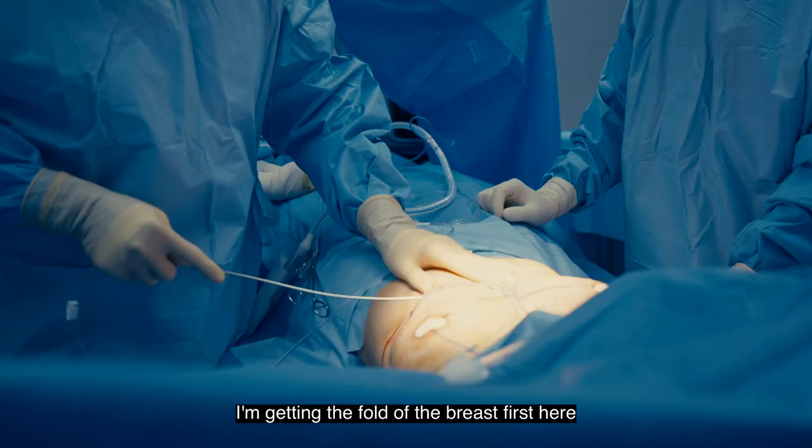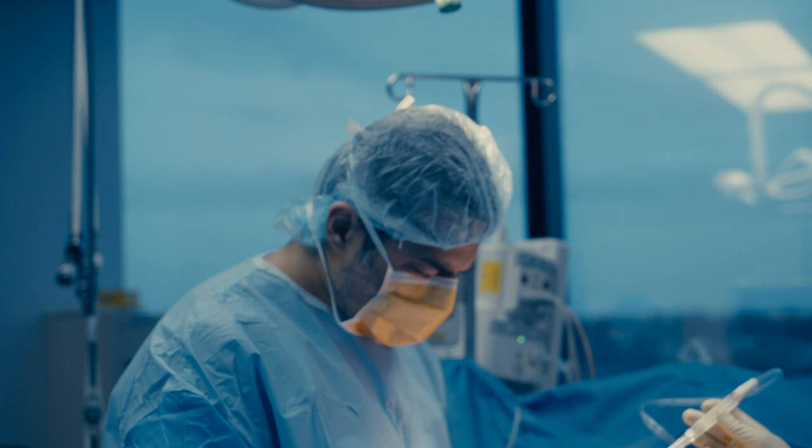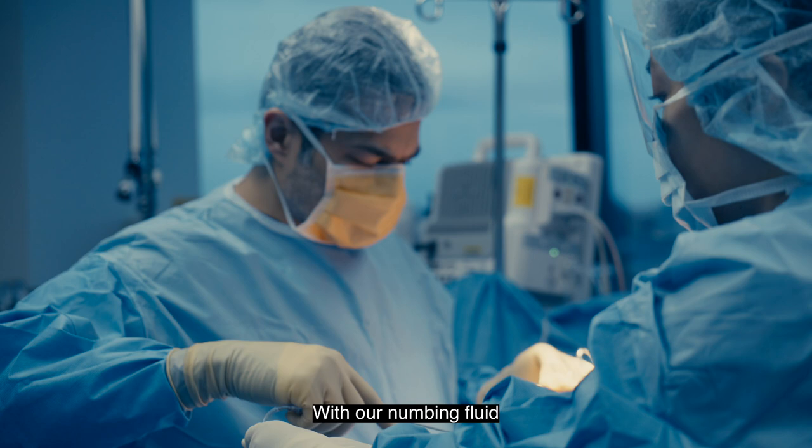We're getting the fold of the breast first. Now we're going to go through the skin, subcutaneous tissue, breast tissue, and fascia to get to the pectoralis major muscle. Then we're going to go underneath the muscle with our numbing fluid.